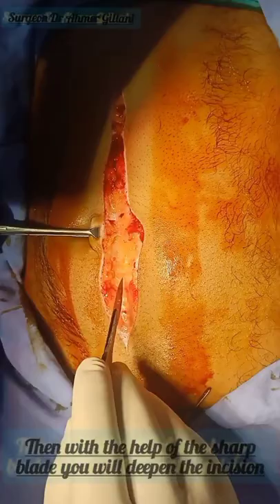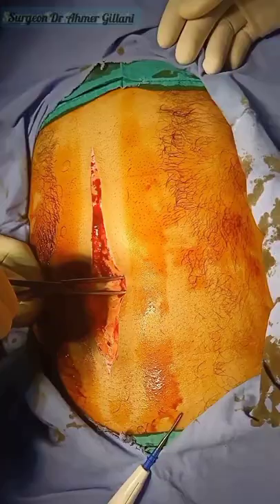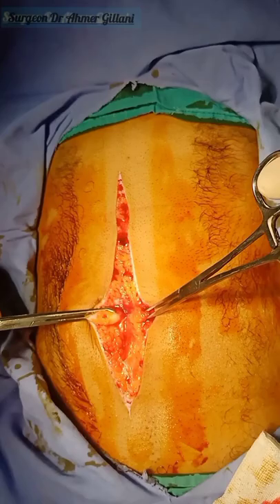You will deepen the incision with the help of a sharp blade. After that, you will use the cautery to secure the bleeding. You will hold the umbilical area for better traction. When bleeding is there, you will mop that area, stabilize, and proceed from the midline. With the help of the sponge, you are mopping the area, then proceed with the unipolar cautery.